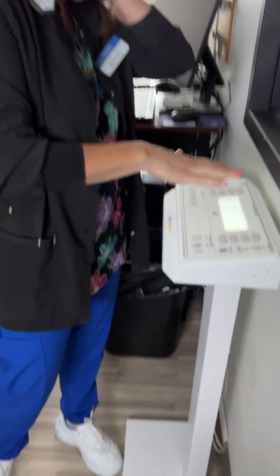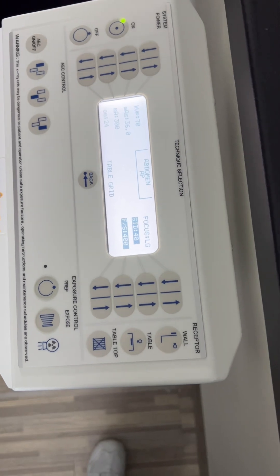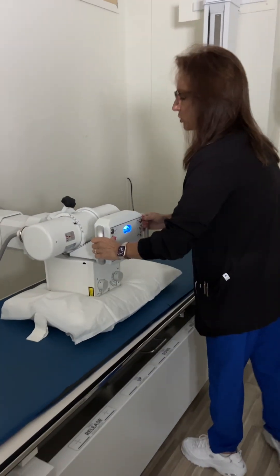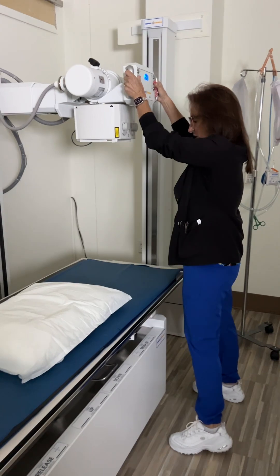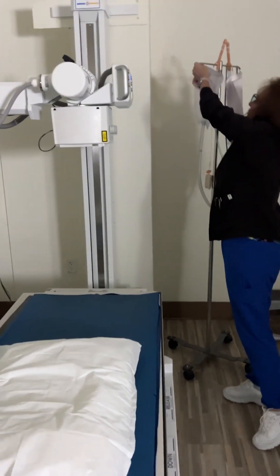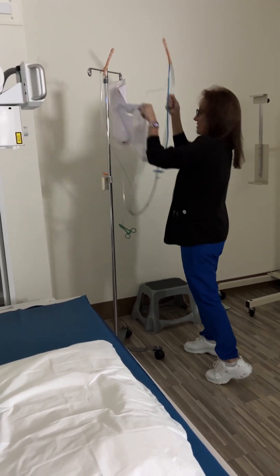I'd set up the control panel for fluoroscopy. I would move the bucky all the way to the end of the table, move the overhead tube out of the way, and have the fluoro tower across the patient. I would already know that my scout was cleared, so I'd get my barium enema bag set up on the IV pole.